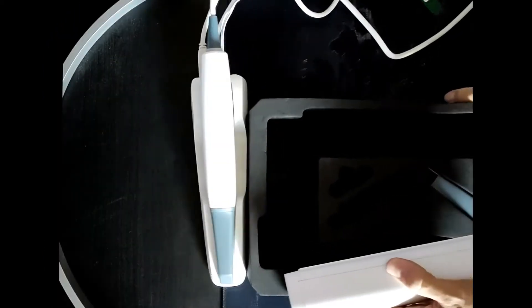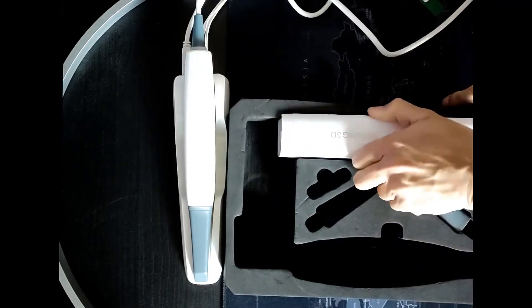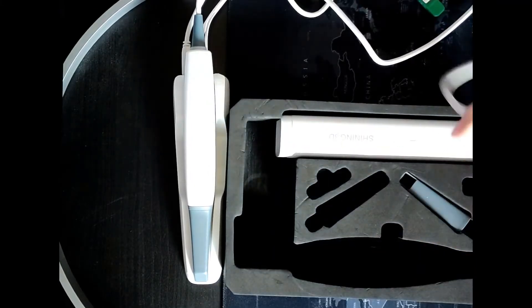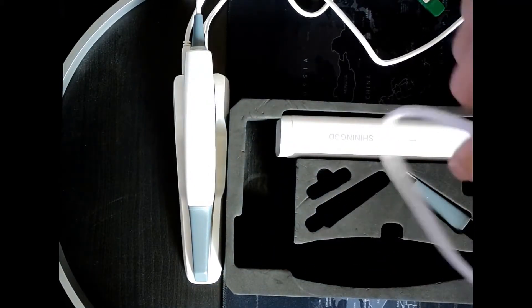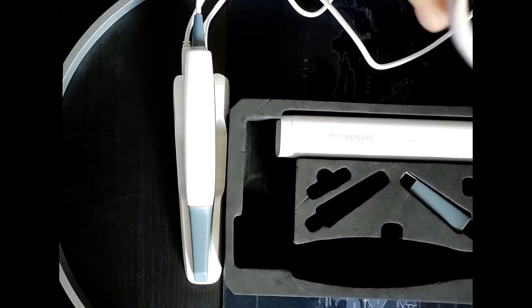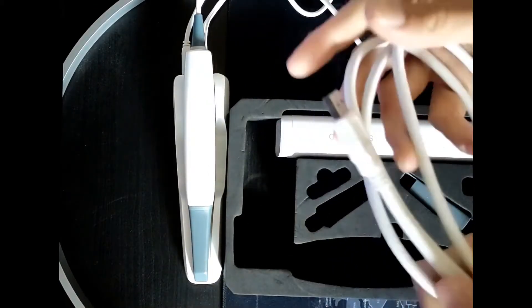I suggest to store the calibration tool in the scanner box.